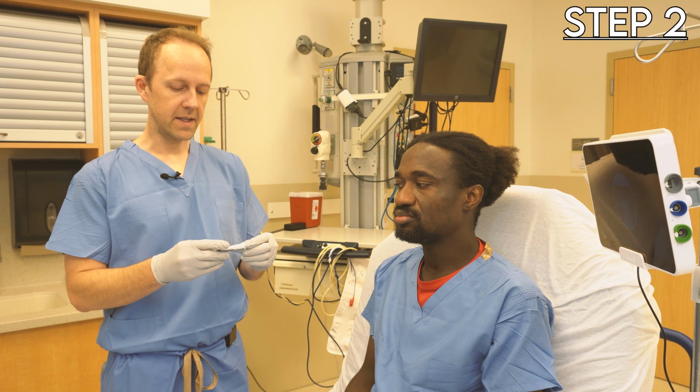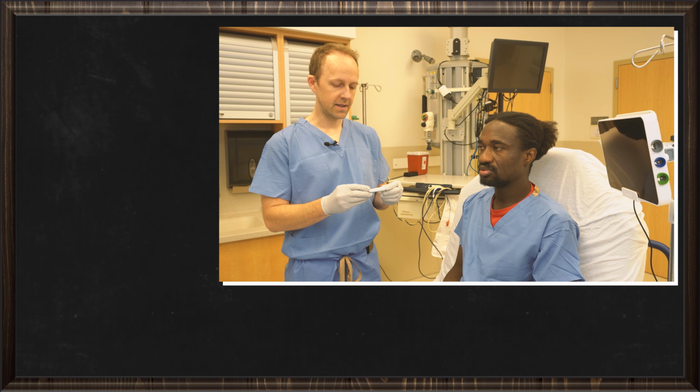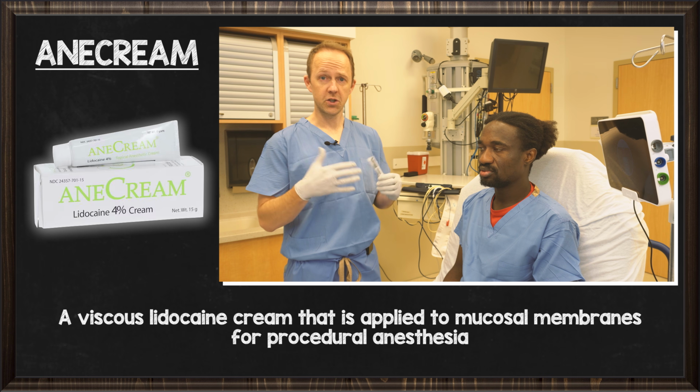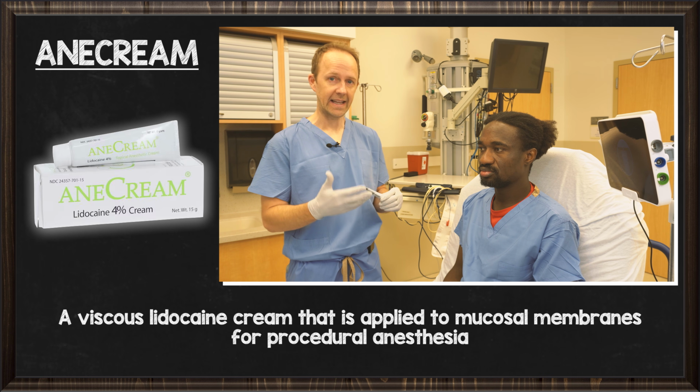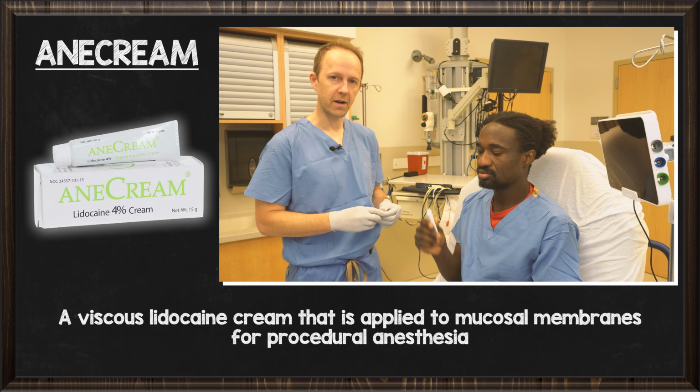Okay, so the next step is numbing the nose. We like to use 4% lidocaine cream. This is a 5-gram tube that has a total of 200 milligrams of lidocaine, and you just snort it in the nose and it coats the whole nasal passage to make it comfortable to dilate and then place a tube. You can either do this or the patient can do it depending on the patient's preference.